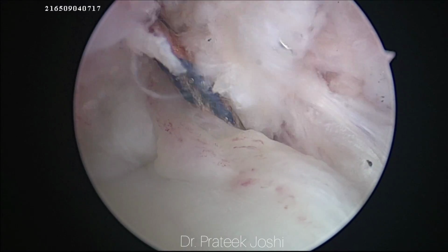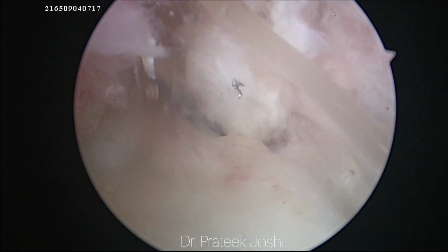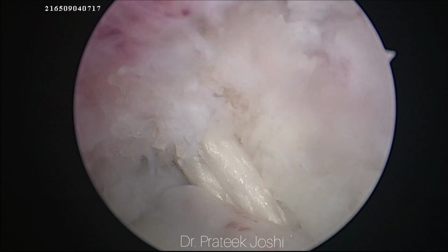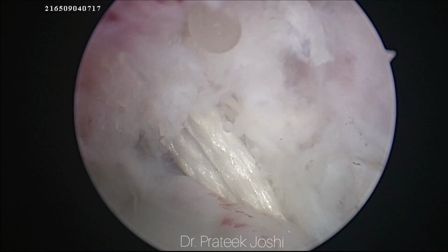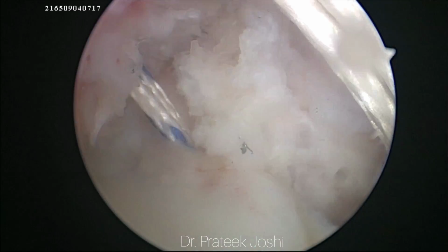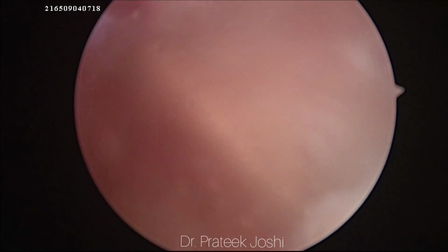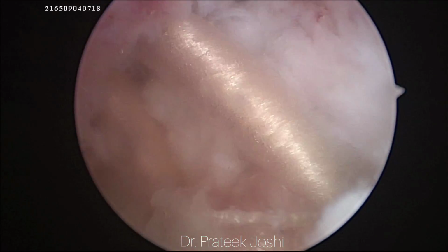So we have prepared our graft over the 20 mm continuous loop endobutton, and now as you are seeing, we are pulling the graft through the tibial and femoral tunnel. Shortly you will see the endobutton passing from the tibial tunnel and going to the femoral tunnel. There are two sets of threads available on the endobutton. One set of thread is to pull the graft with the button through the tibial and femoral tunnel, and the other set of thread is to flip the endobutton as it crosses the lateral femoral cortex.